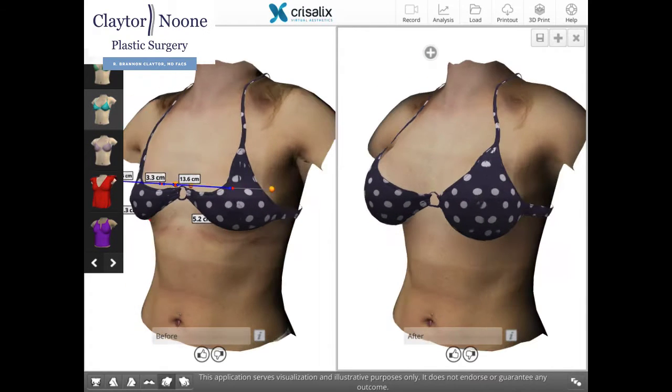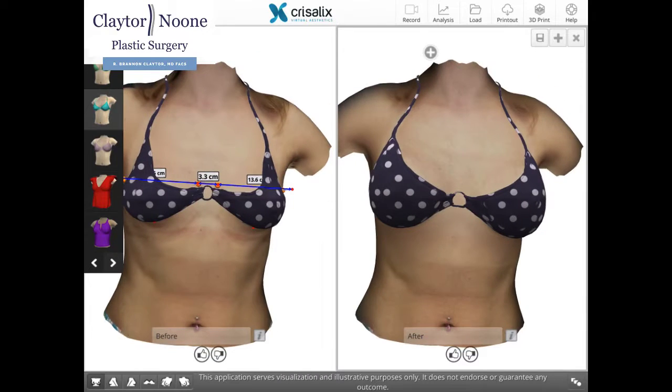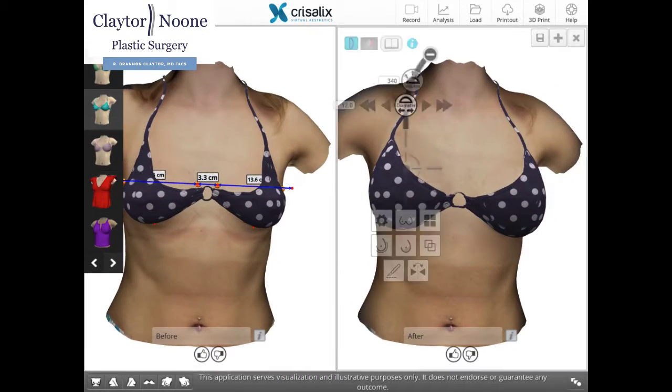Chrysalix is a proprietary virtual reality simulation, which is like a Pixar animation but uses the patient's own biodimensional analysis to measure the base diameter of the breast. This provides a framework for the implant's selection.